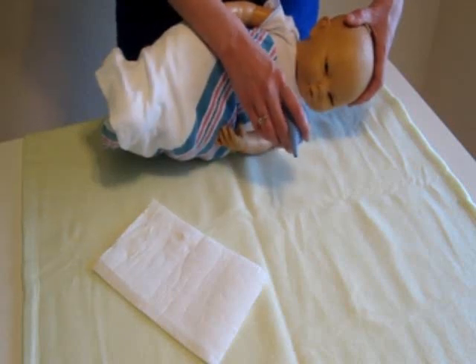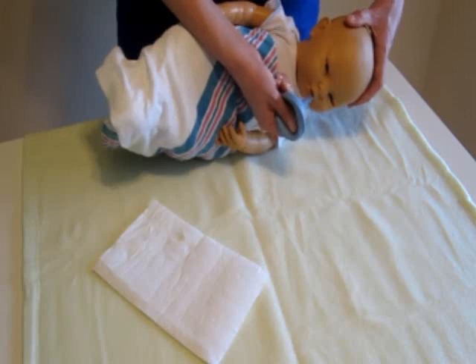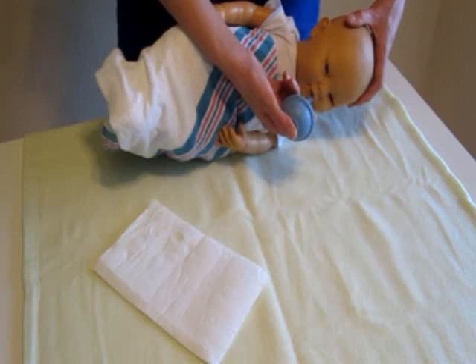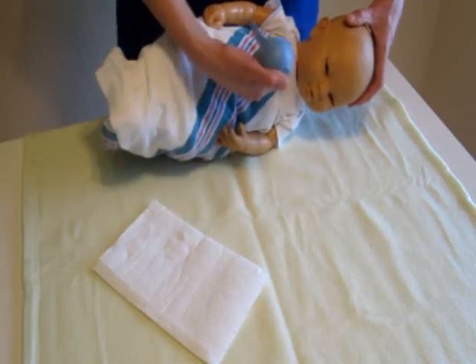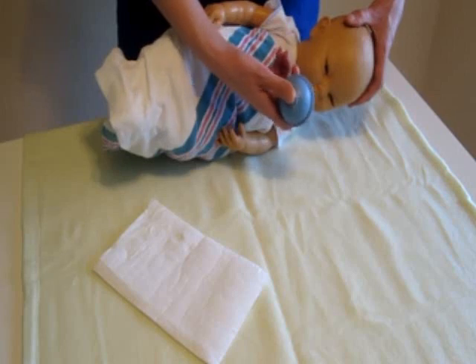So compress the bulb away from the face, put the syringe into the side of the mouth, release the bulb syringe, and then empty your contents onto a paper towel, a washcloth, or anything that you have handy. If you see more contents, then go ahead and do it again.